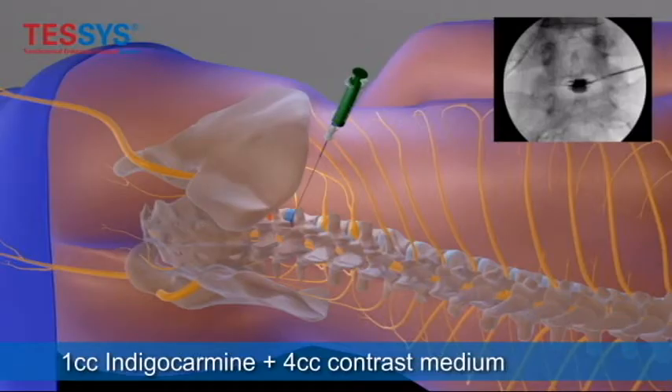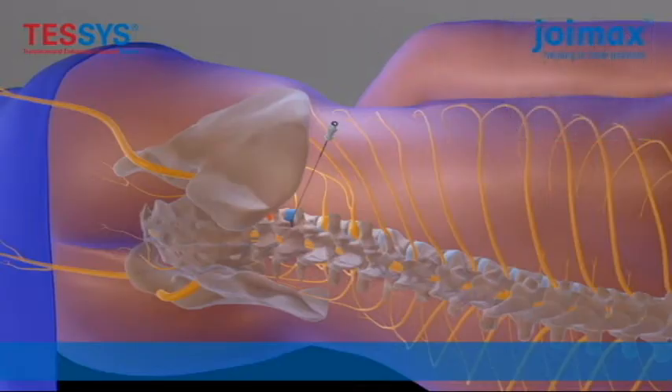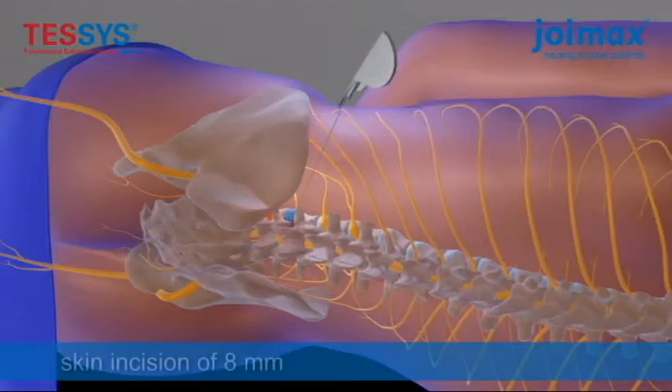This is a discography, which you can see on x-ray with indigo carmine. This impregnates the nucleus pulposus and also the herniated disc, which is visualized endoscopically to help facilitate the location of the herniation.